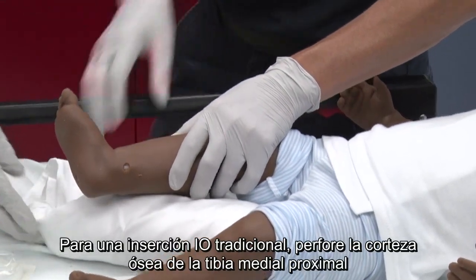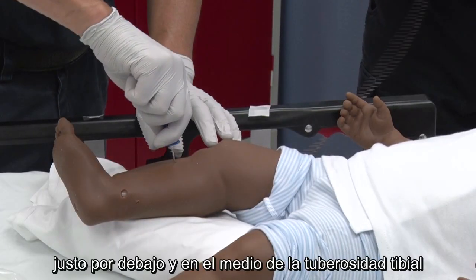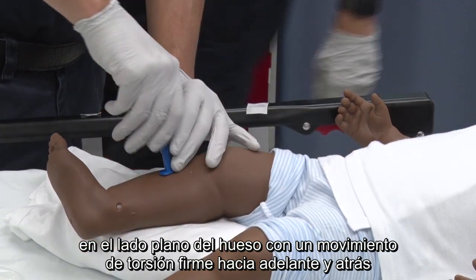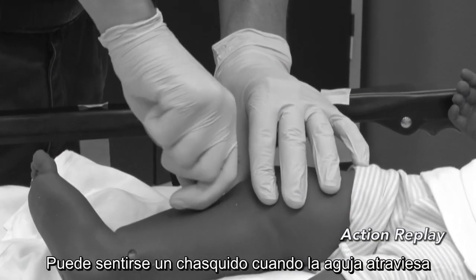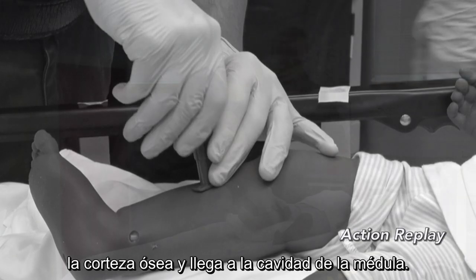For traditional IO insertion, pierce the bony cortex of the proximal medial tibia just below and medial to the tibial tuberosity on the flat side of the bone with a firm back and forth twisting motion to enter the marrow space. Do not push hard on the needle. A pop may be felt as the needle passes through the bony cortex and into the marrow cavity.